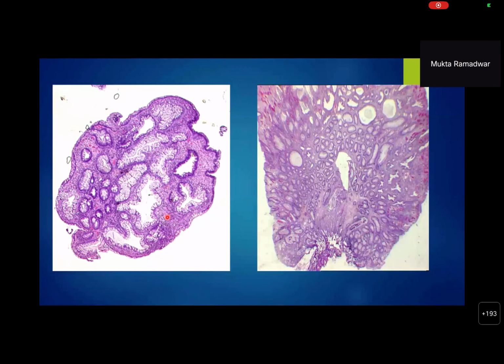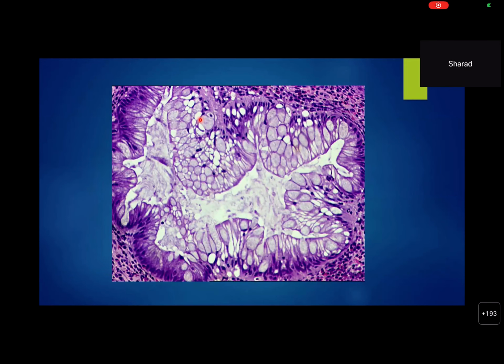And do you think that, like the adenomata that we just saw, it resembles the adenoma? Is there any dysplasia here? In low power view, I don't think so. Focally at the left, this is the higher mag. Now you can see basally located nuclei. There is some crowding, but no nuclear enlargement, no pencil-shaped morphology. And there is this infolding, the so-called serration that you can see. Yeah. So this is not an adenoma like we looked at earlier, whereas this is a serrated polyp. Okay, a class of serrated polyp that we're looking at.